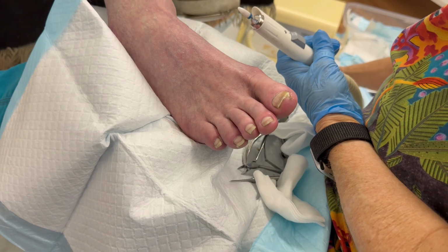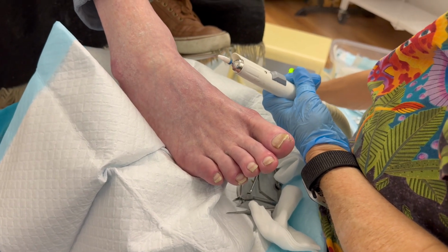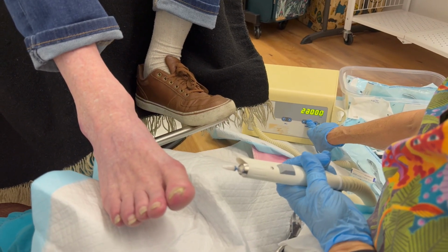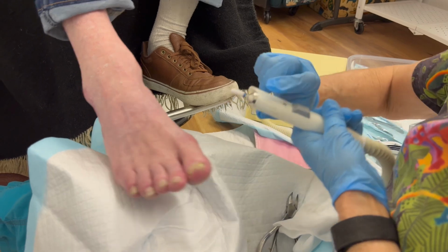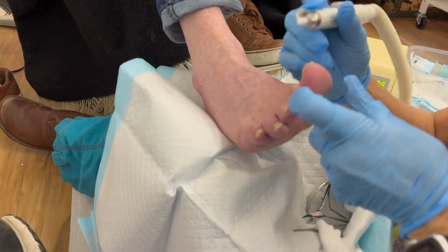Okay, so we're going to turn it on. There we go. We're turning up the vacuum power. We're turning up the RPMs up to as high as it goes, which is, wow, 40,000 RPMs. Yep, I feel a little suction there.